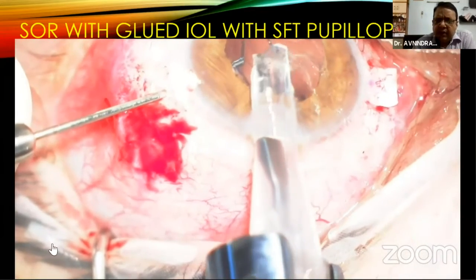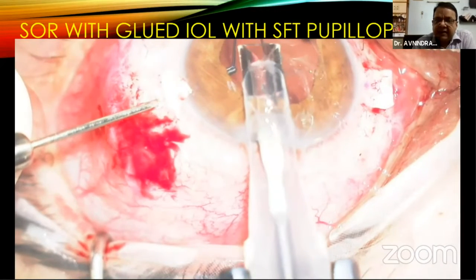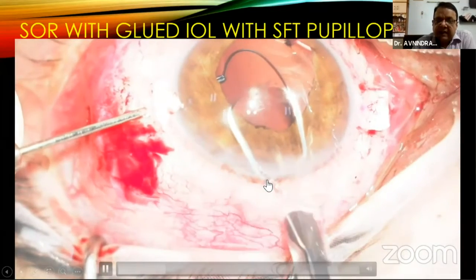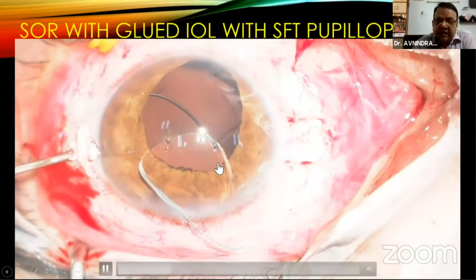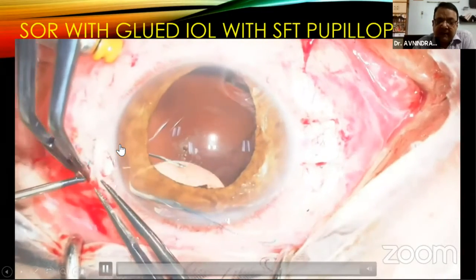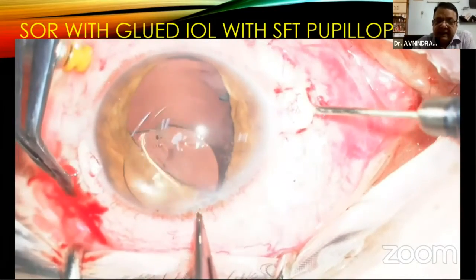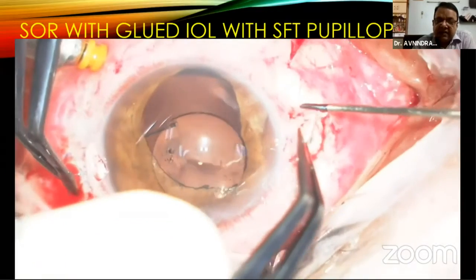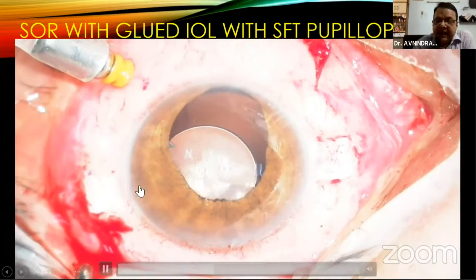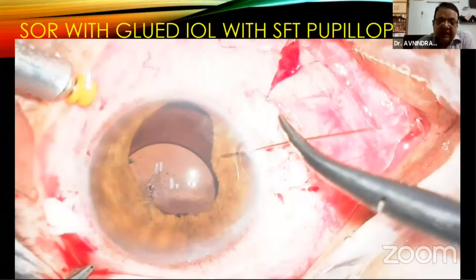So what you do, you coat the endothelium with chondroitin sulfate, and just press the posterior lip. The infusion is there. The oil comes out through this tunnel. Then the three-piece IOL is injected into the eye. The important thing here is catch the tip and only externalize once the whole lens is delivered. The second haptic is also externalized, and these haptics are internalized into Scleral tunnels, which are made by a 26 gauge needle.